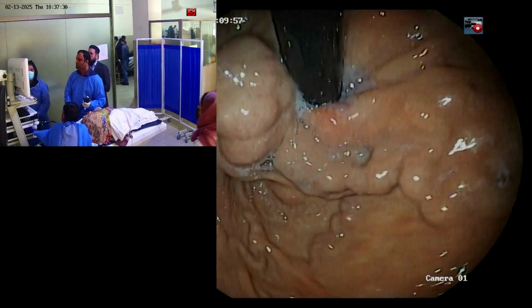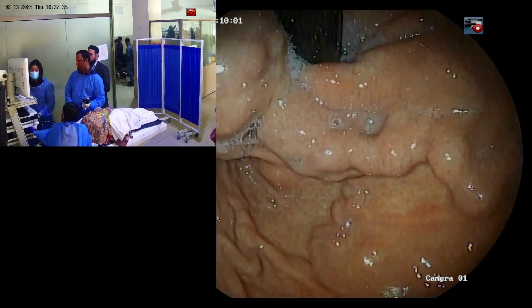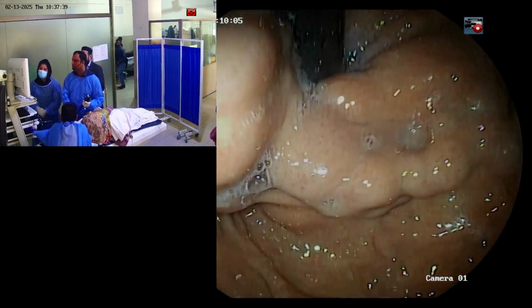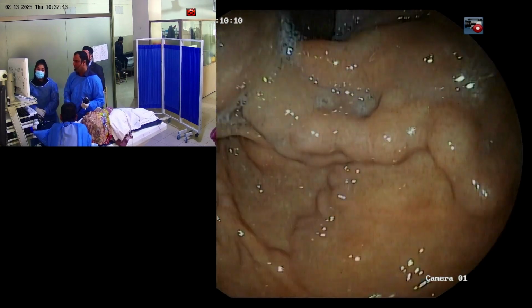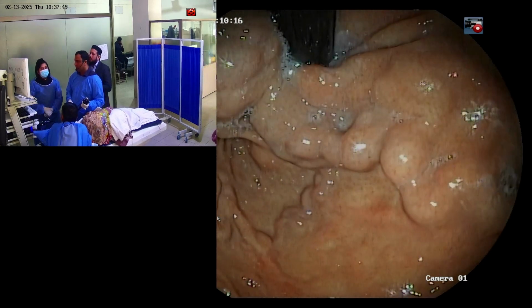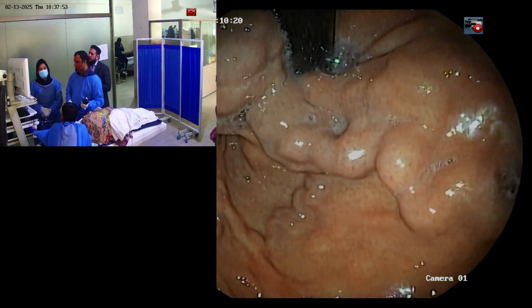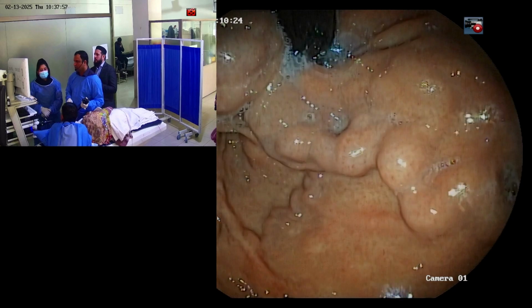migrate. And in their review, they found that about 40% of these people, when they followed with the CT angiogram, had pulmonary emboli. So if you inject more, there is a high risk of getting emboli. The idea of putting coils is that the glue doesn't migrate, there are fewer chances of emboli, and you inject a small quantity that binds to the coils.